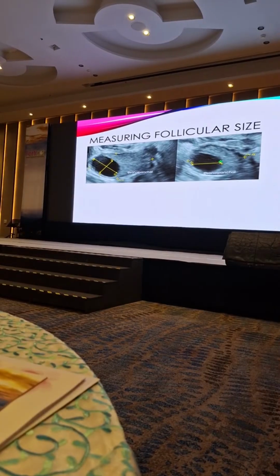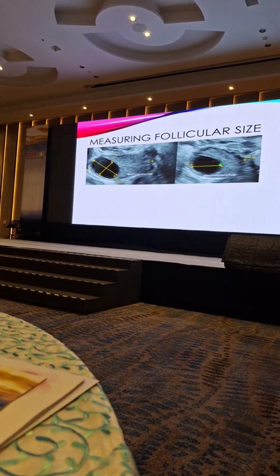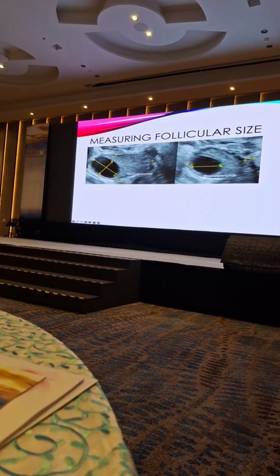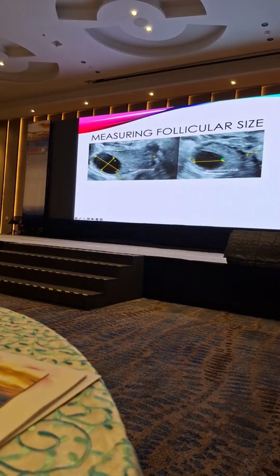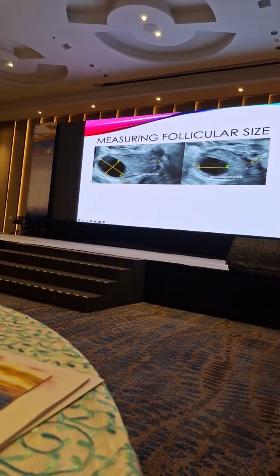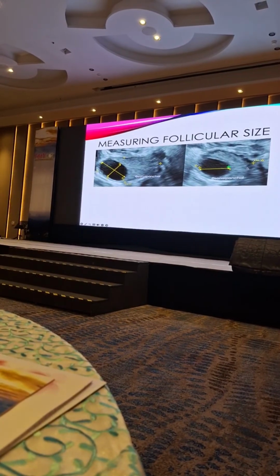So whenever you see a follicle, rotate the probe, find out if it elongates, find out the longest section, and freeze it on one of the images of the dual frame. Do a 90-degree anti-clockwise rotation, take a transverse section, take the longest diameter perpendicular to the long diameter, and the widest side-to-side diameter parallel to the x-axis, and the mean of these 3 is your mean follicular diameter.